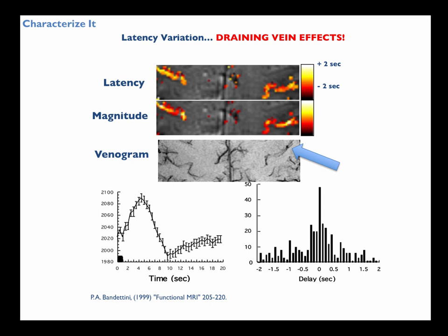So that's a real problem that we're still grappling with, because you have to first do either a vessel mask or characterize the latency in some way to pull more information out.